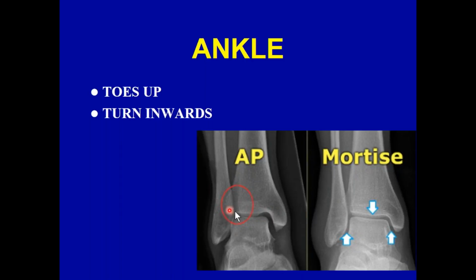ray goes, halfway between the medial, the lateral, or the fibular malleolus and the medial malleolus. But by you turning inwards, pigeon-toed, 5 to 10 degrees inwards, we're able to see the lateral portion of the fibula more clearly. And when you roll over on your ankle, it's this part where the laser pointer is now that you hurt. You can hurt the malleolus, but you can also hurt the ligaments that are attached to this. So the fibular calcaneal ligaments. We can get a lot more information by you turning the foot inwards.